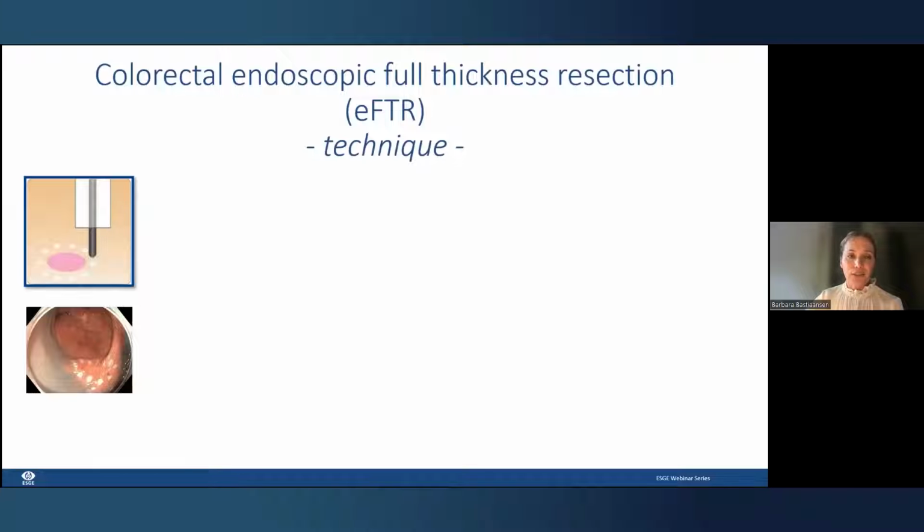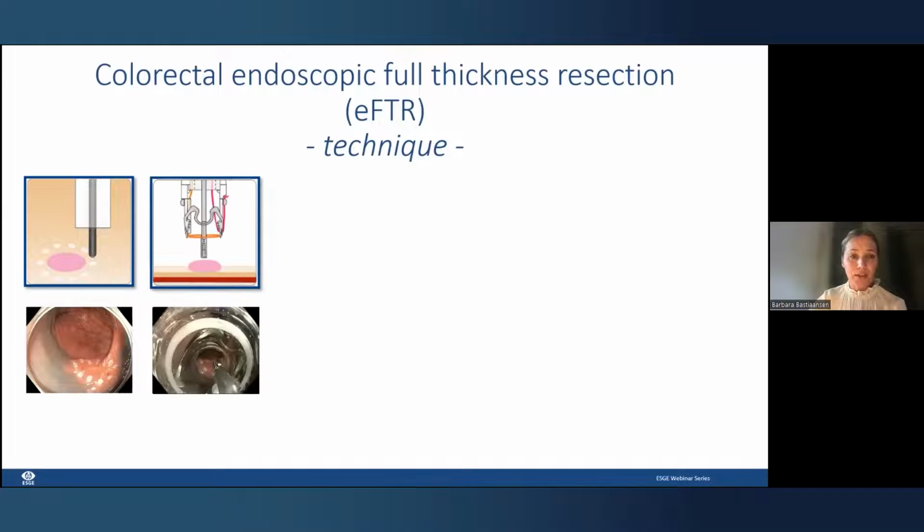So these are the basics. It's usually three endoscopies in one procedure. First you go in without the device to check your lesion and to mark the lesion, which I think is quite important, because the long cap takes away light and visibility. So it really helps to recognize the lesion once you are there with the device, because the second introduction is, of course, with the mounted device.